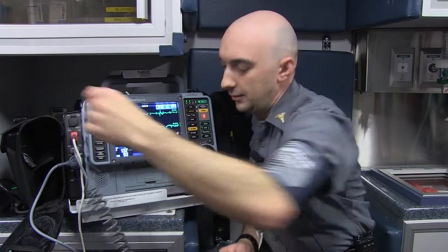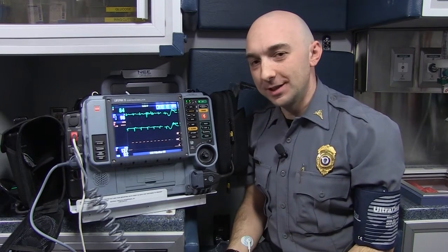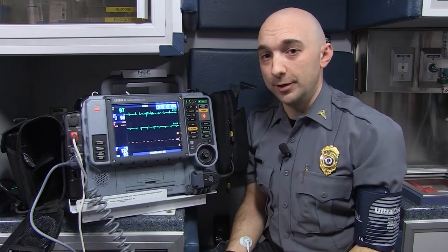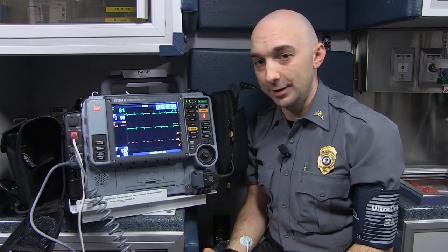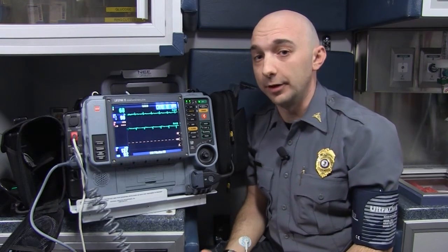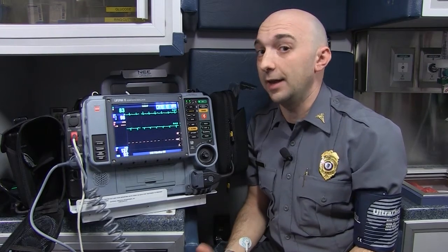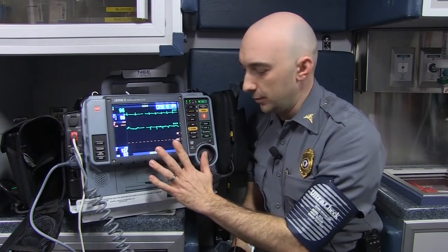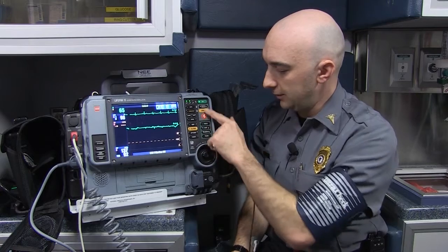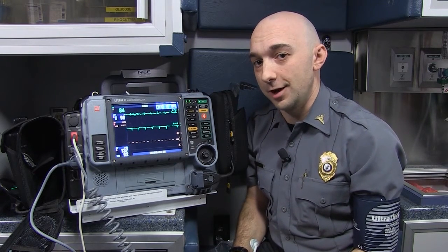Just like an automatic external defibrillator that you learn about when you learn CPR, this is a manual defibrillator. That means a paramedic is trained to do everything themselves — interpret the rhythm and figure out how much electricity to deliver and when. We can give electricity in different amounts based on different rhythms that an AED can't do on its own. Once we use the machine to figure out what's wrong with the patient, we can turn to this side of the machine — all these bright yellow and orange buttons — and that's how we deliver a shock. The paramedic makes the decision about when to shock and treat a patient.